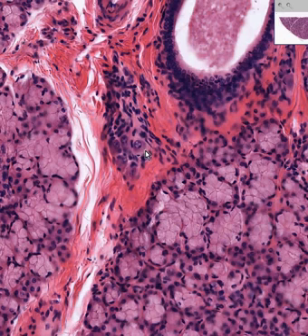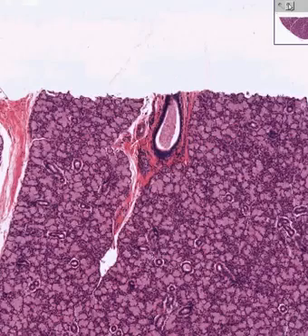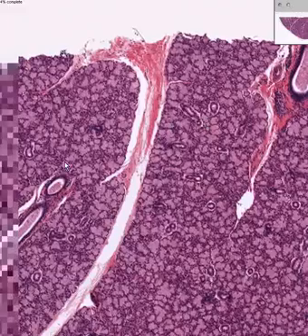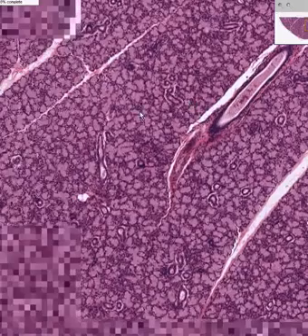And even if you don't see all 4 or 5, even if you see 2 or 3, you might guess that it probably is anyway. And don't forget, you're allowed to see a lot of lymphoid tissue within salivary glands, and sometimes, like we saw in the parotid, even an entire lymph node. So let's see if we could find groups of lymphoid cells in here, or whether we're not going to get lucky. Well, there aren't too many. I'm sure that they're individually dispersed here and there, but I don't see any primary or secondary follicles.